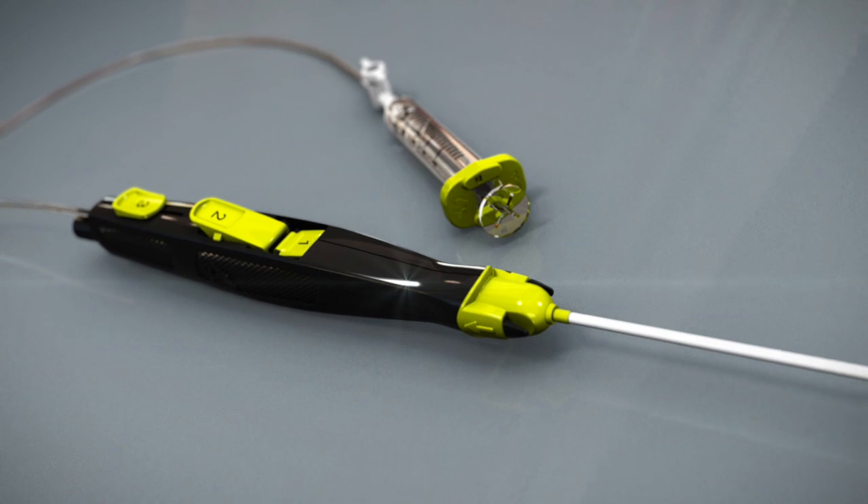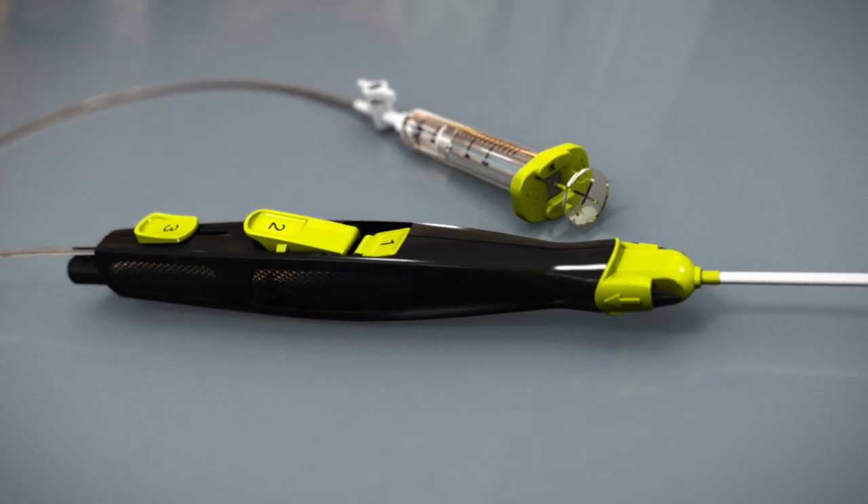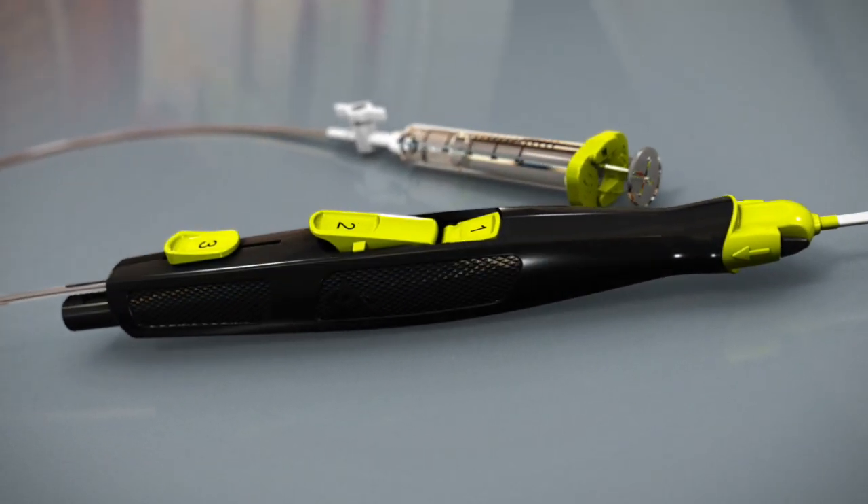The MinxAce Vascular Closure Device from Cardinal Health, providing closure you can count on.